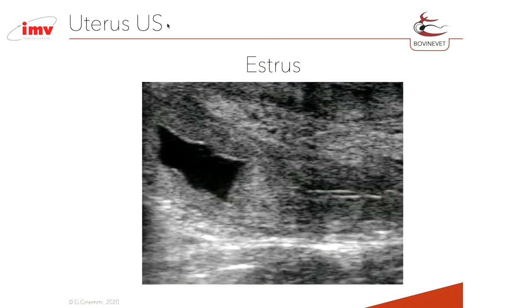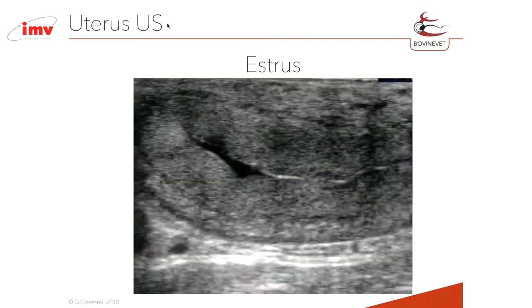So you see that it's very easy to distinguish the uterus in function of a steroid hormonal profile that may be estrogenic during the follicular phase or progestinic during the luteal phase. In another section, in this case longitudinally, you see that very close to the estrus moment, the difference in thickness between the contracted myometrium and the thicker endometrium is very high. Sometimes we have a myometrium to endometrium ratio of 1 to 2, 1 to 3, until 1 to 4.